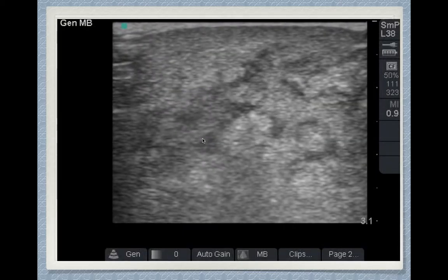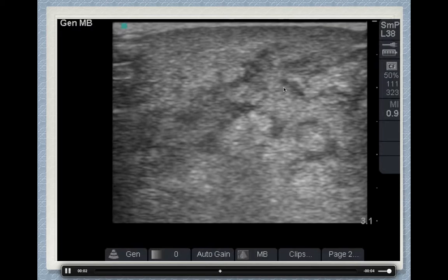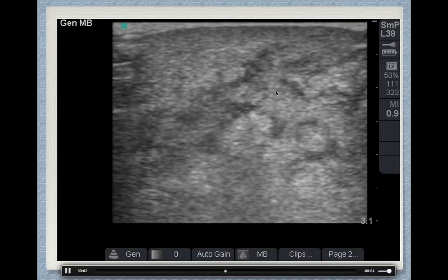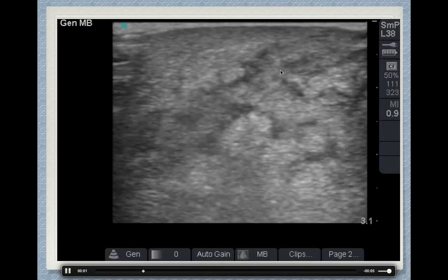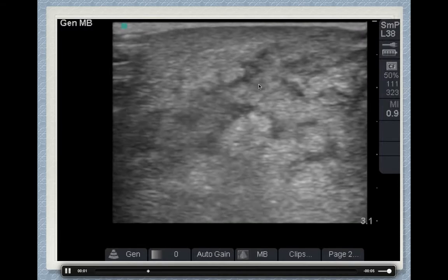Again, tough to determine right at this onset, right at the beginning. It doesn't look like much, but as you move around your probe and as you apply some pressure, you're going to see some movement of material, of purulence in this area. So whereas someone you wouldn't necessarily drain initially, make sure that you do these small, subtle movements, such as putting pressure and scanning through the entire object that you're worried about to see if there's some movement of fluid.